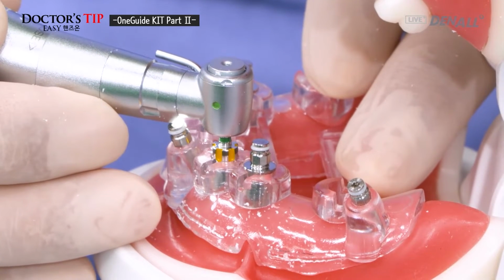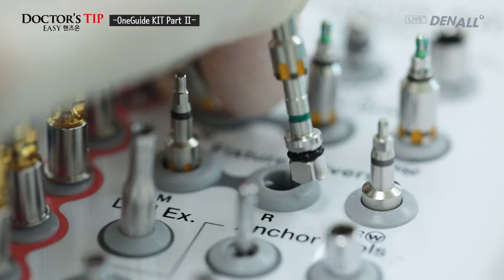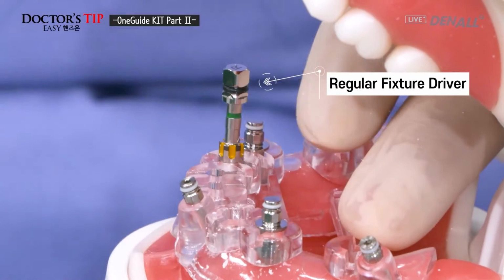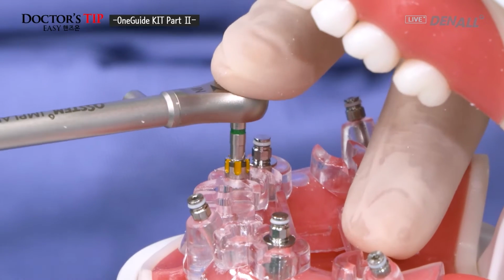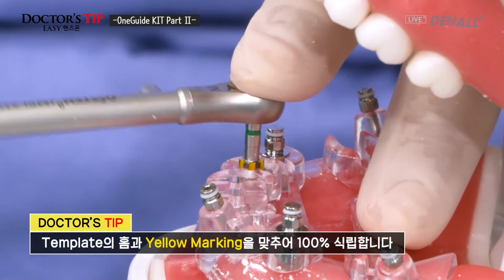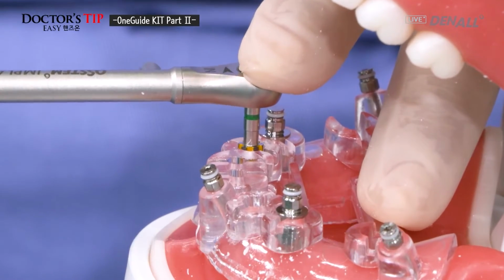It is going to be placed using engine about 80% and fixture driver regular size is selected. So the fixture within the bone, check whether it's in contact and using hand wrench. Finally, you're going to get the implant position. The guide hole and the yellow marked area is aligned. Drilling is done for this.